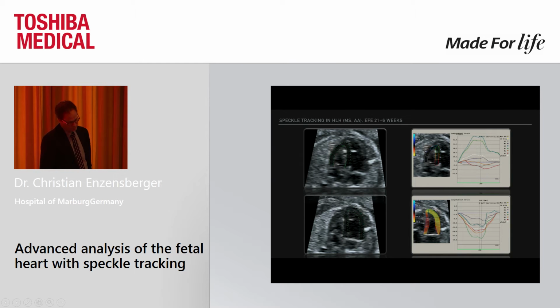Another case, the hypoplastic left heart with endocardial fibroelastosis, first of all the left ventricle. Even though we know this ventricle is not useful in this pathological case, it is just to show how the myocardial deformation has changed dramatically.